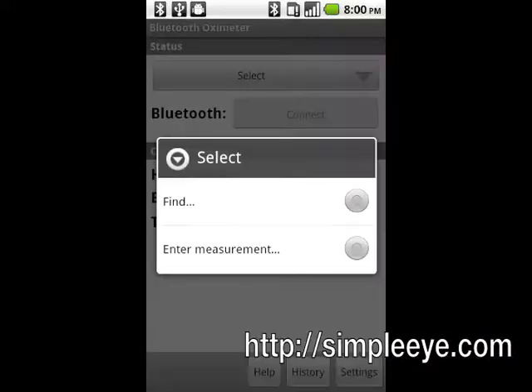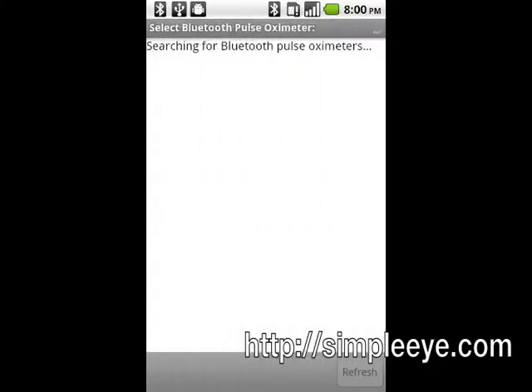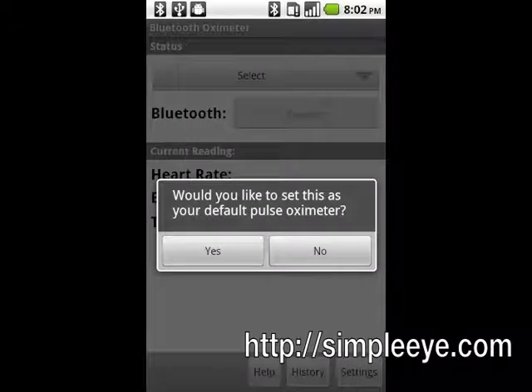Press the Back button to return to the measurement screen and connect to the pulse oximeter. Tap the Select button and then tap Find to search for the oximeter. Once it has been found, tap the pulse oximeter to select it. You will be prompted to set this pulse oximeter as your default. Tap Yes.